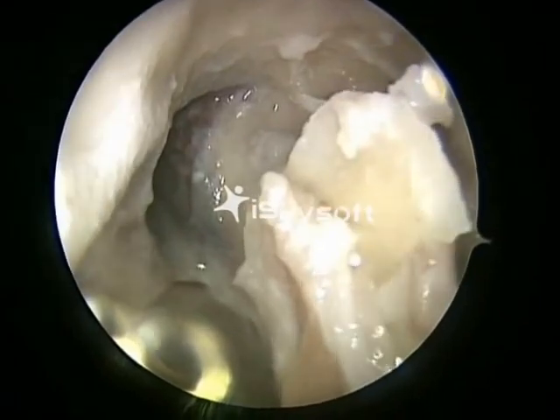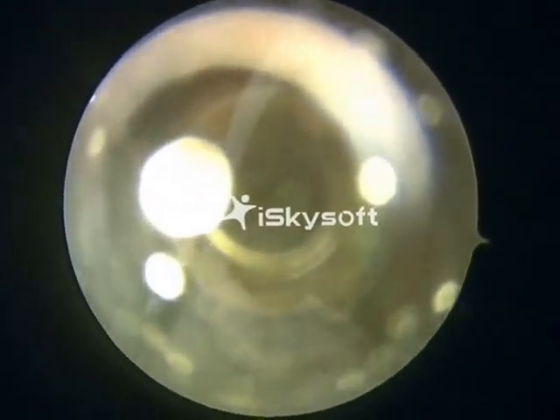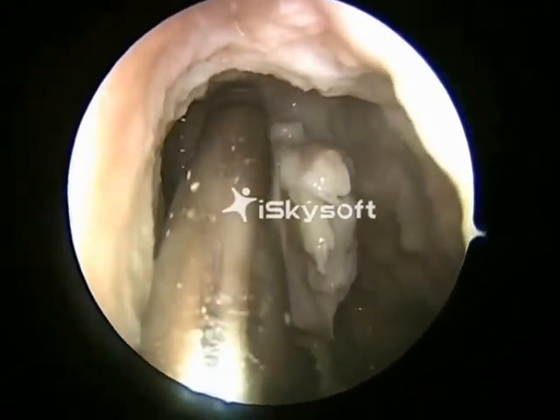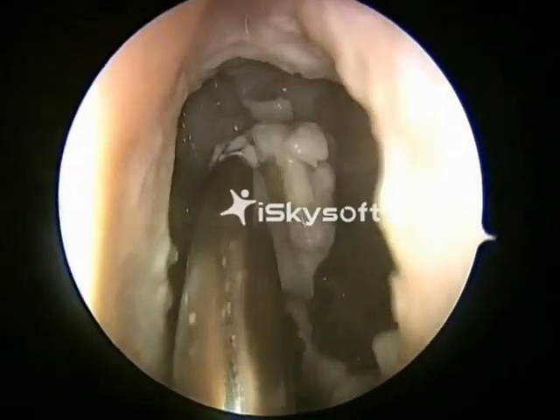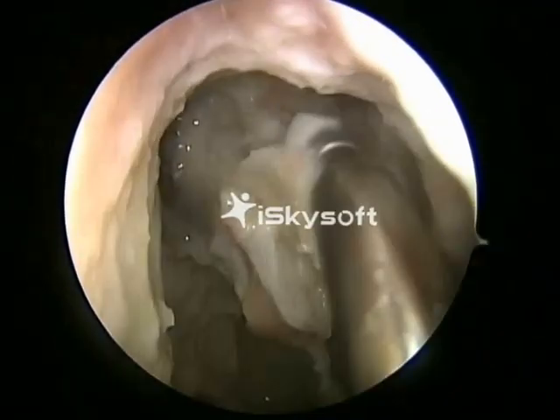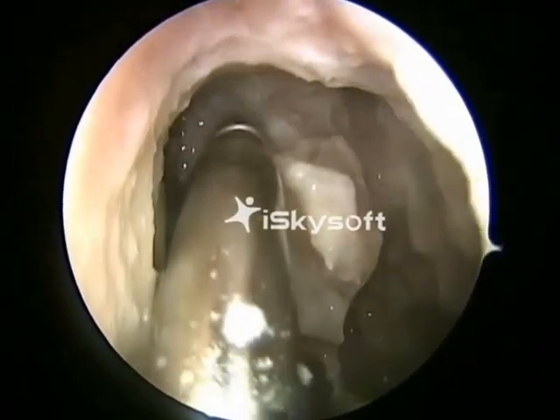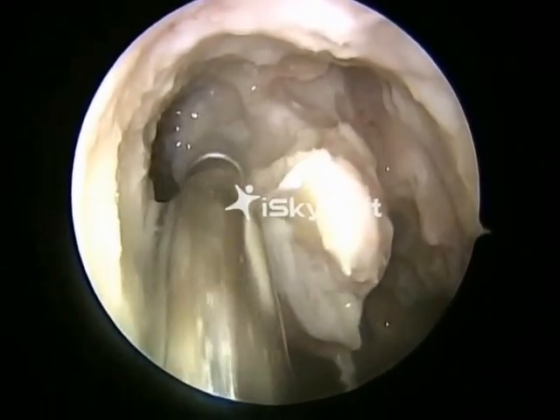You can see that the interfrontal septum has been reduced very nicely. The final part of the Draf 3 procedure would be to reduce the frontal T. The frontal T is formed by the anterior end of the middle turbinate on both sides and the superior edge of the nasal septum.